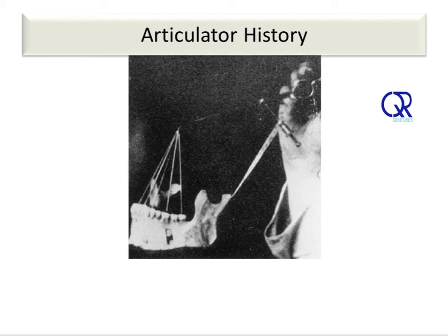On the human mandible, he discovered that when measuring from this common centre, a dividing caliper not only touched the incisal edges of the anterior teeth and the buccal and lingual cusps of the posterior teeth, but also bisected both of the condyles. This study was the origin of Monson's spherical theory.